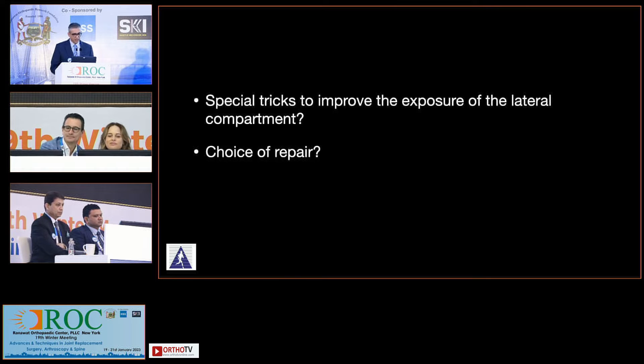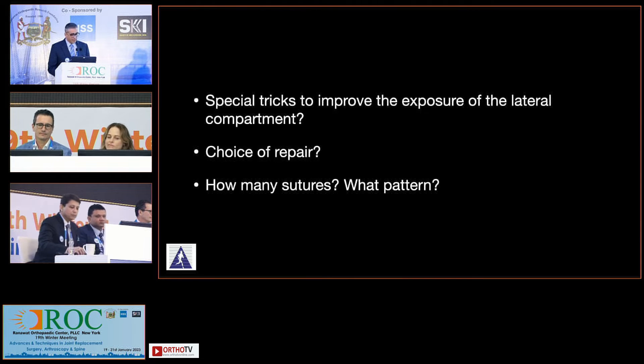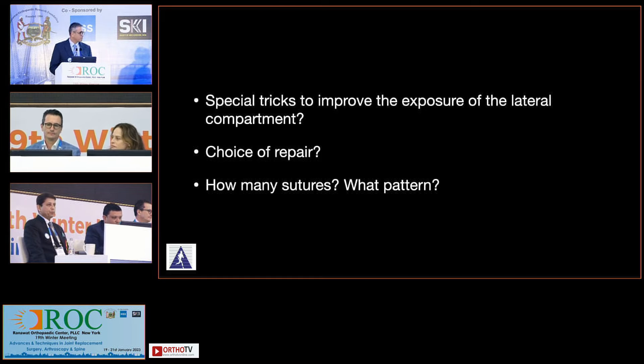Choice of repair — all inside, inside out, outside in. I always prefer all inside. It looked more like a body and posterior horn part where there was a tear on the superior and inferior surface, so my choice would be all inside. For the posterior part I would put some horizontal sutures, and anteriorly I would prefer to do outside-in vertical sutures.